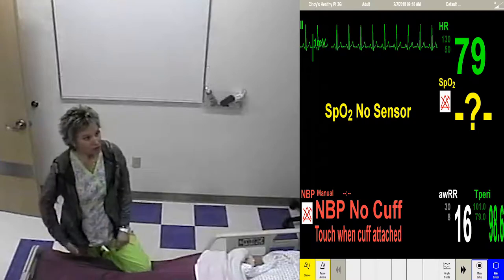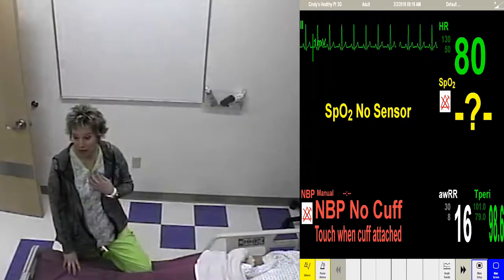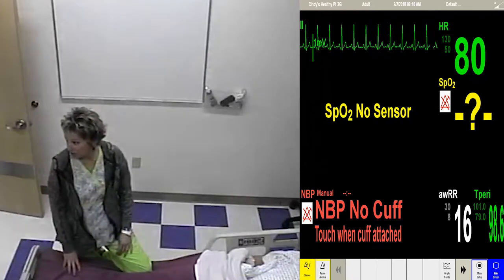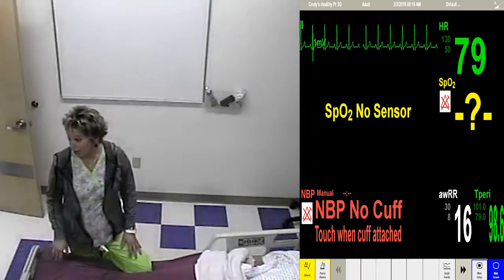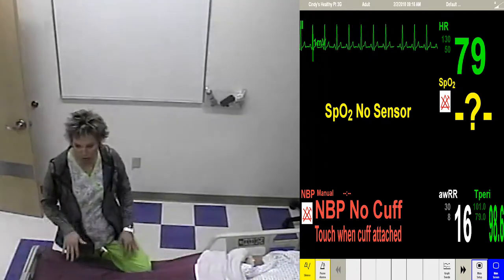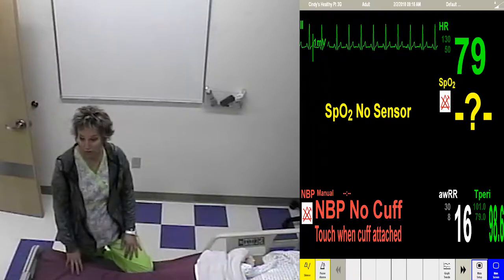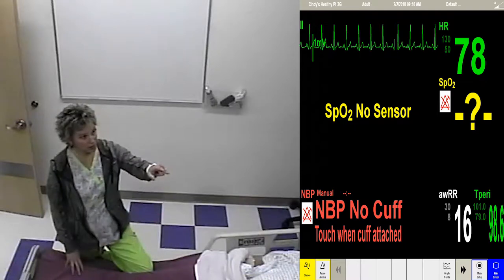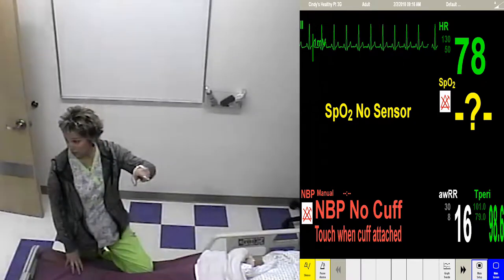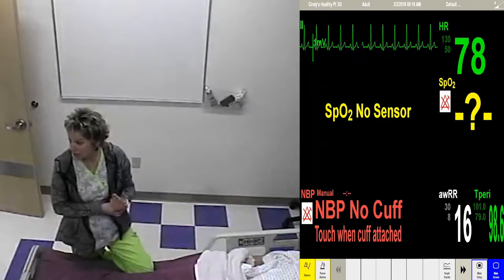Okay? I'm going to teach you kind of like on a kindergarten level, because that's how I like to learn. So it's going to be really easy. And if at first you say, I don't get it still, hang in there with me. By the time we're all done, I think you're going to understand it a little bit better. I'm just going to teach you the basic stuff. So all you're looking at is the green rhythm. We don't care anything about the O2 sat, blood pressure, any of that bottom stuff.